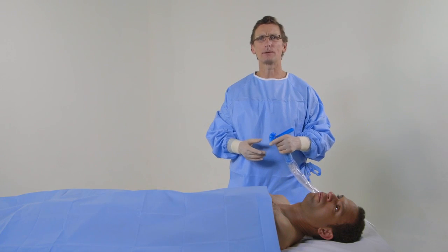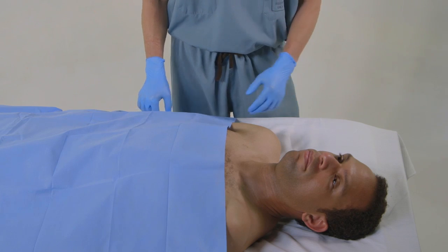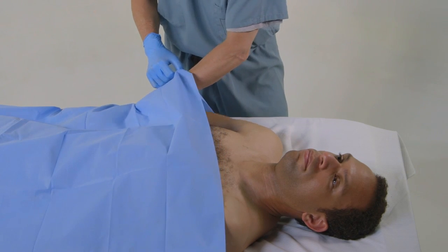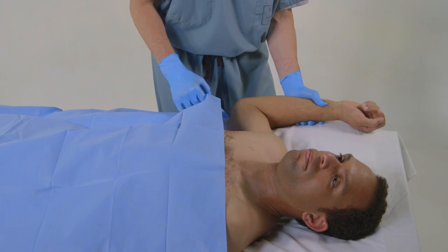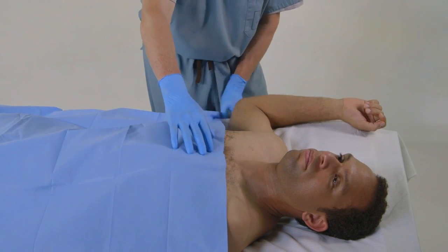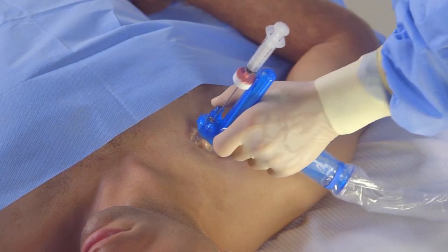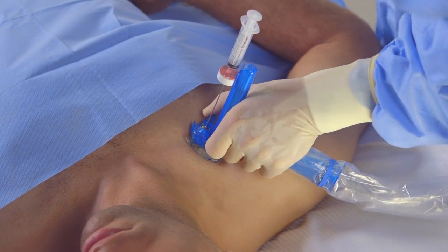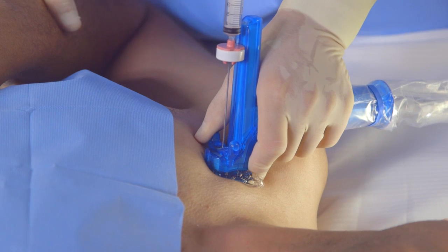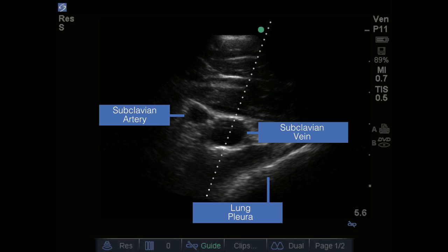Now, I will show on our model an example of how I perform a subclavian central line using AxoTrack. To begin, it is often helpful to reposition the patient's arm to find the best view of the subclavian vein. A good starting point is with the patient's arm in the throwing position. Apply a liberal amount of sterile gel and place the probe at the angle of the clavicle and point underneath the clavicle. While still maintaining gentle pressure on the needle clamp, scan back and forth to find the subclavian artery and medial to that the subclavian vein.